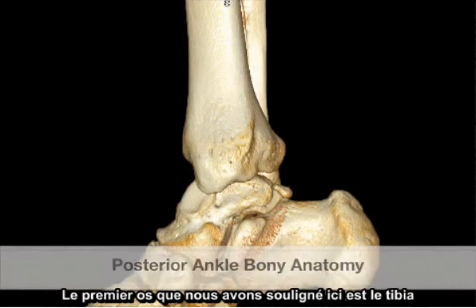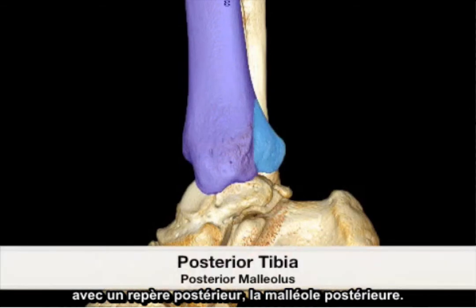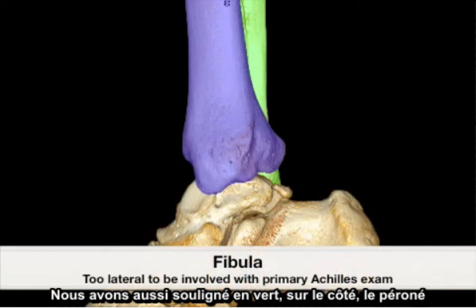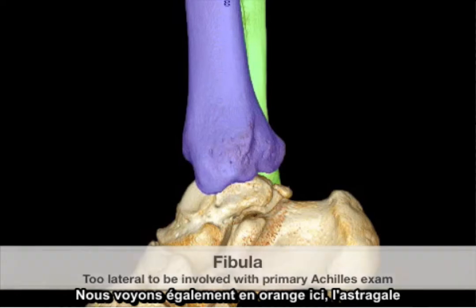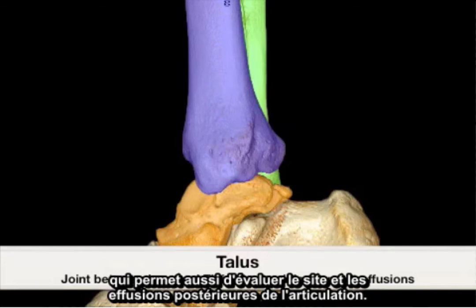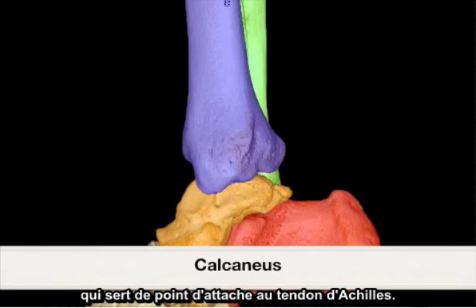The first bone highlighted here is the tibia, with the posterior landmark of the posterior malleolus. Also laterally in green, we have highlighted the fibula, which is typically not associated with the Achilles tendon examination. Highlighted in orange is the talus bone, which is responsible for evaluating most posterior joint effusion. The last bone, highlighted in red, is the calcaneus, which will serve as our anchor point for the Achilles tendon.